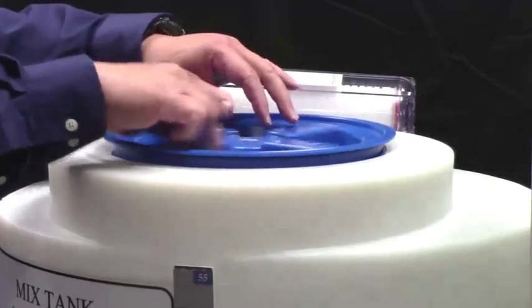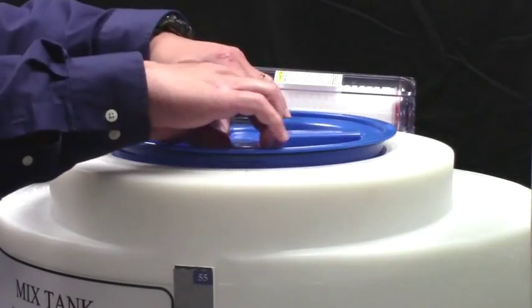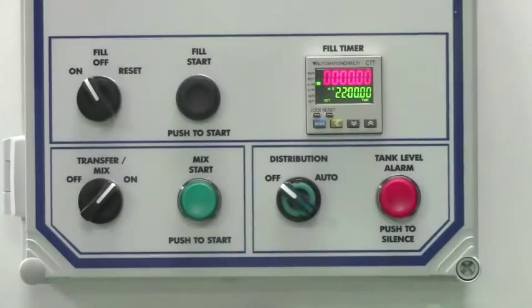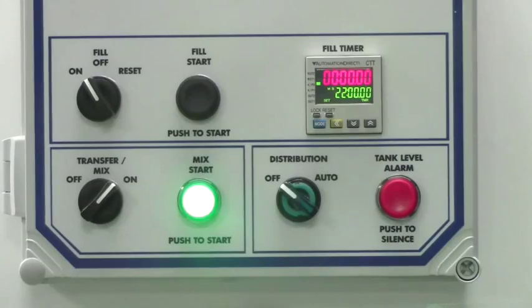Close the lid and allow the bicarb to mix for the preset mix time. When mixing stops, remove the lid and verify that all bicarb powder has dissolved. If there is any powder in the tank that has not dissolved, close the tank lid and push the mix start button to remix until it is dissolved.